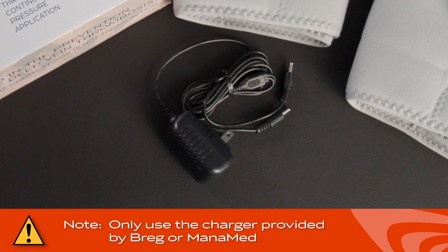Note: only use the charger provided by Breg or ManaMed. The use of a different charger can cause excessive heat, damage to the circuit, and shorten the life of the battery.